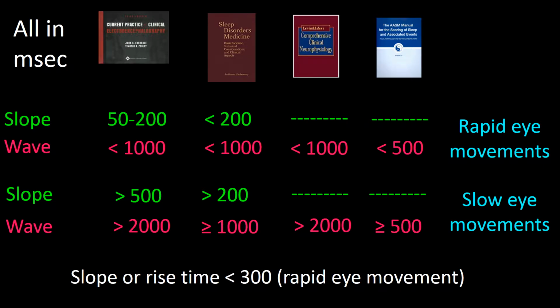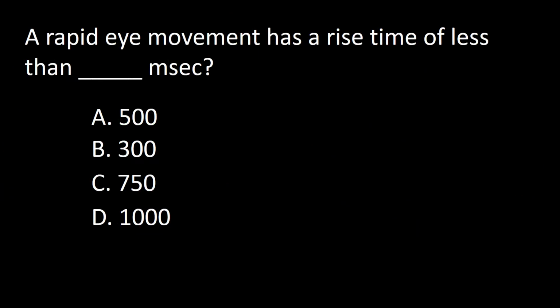Others classify rapid eye movement as having a rise time of less than 300 milliseconds. So the answer to this question is B.